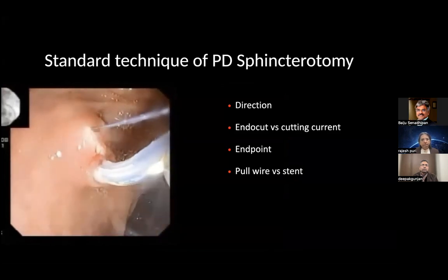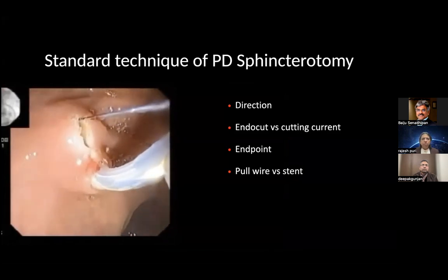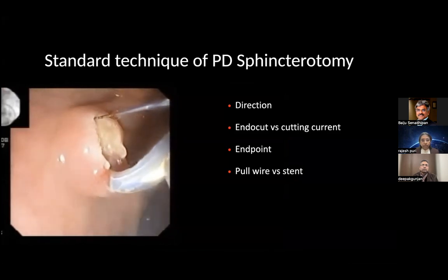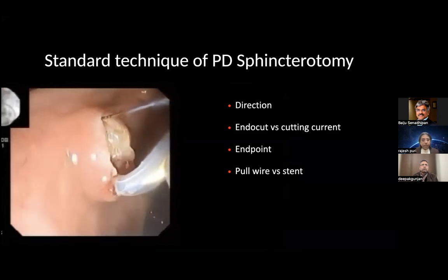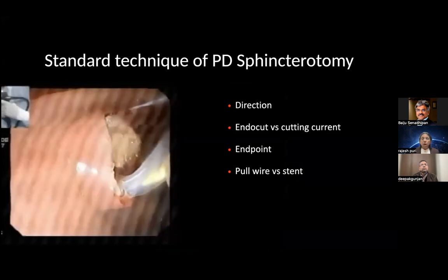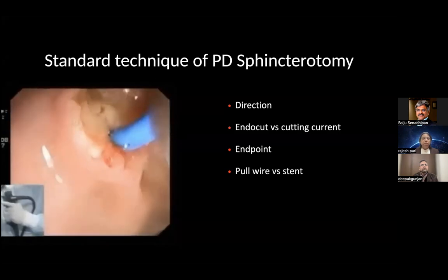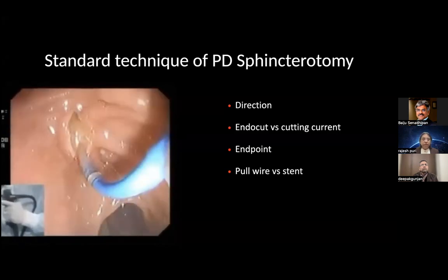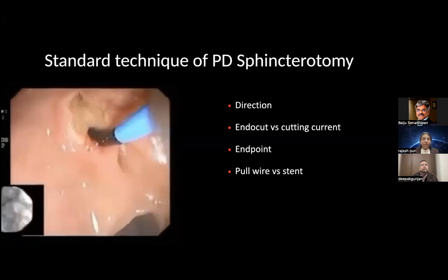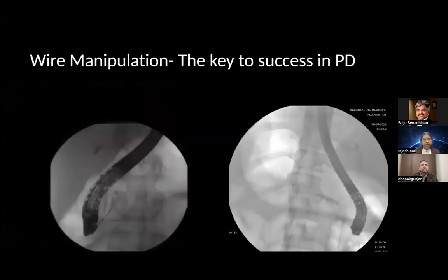And what should be the end point of the pancreatic papillotomy? As in the biliary sphincterotomy, you can do a long pancreatic sphincterotomy. That is the best way. In a patient of chronic pancreatitis, God has given a liberty that you can fiddle with the pancreatic duct, but mind it, always use the indomethacin suppositories, hydrate the patients, and then try to cannulate the pancreatic duct.